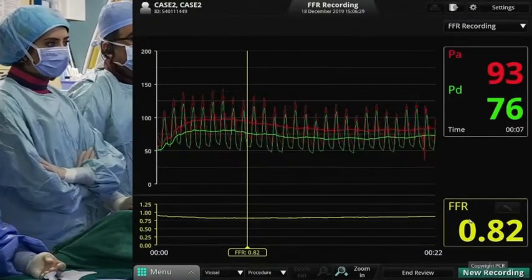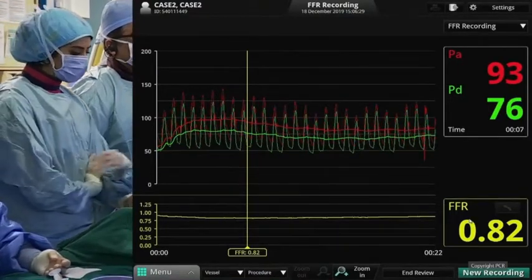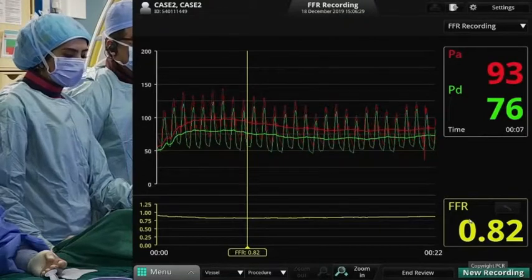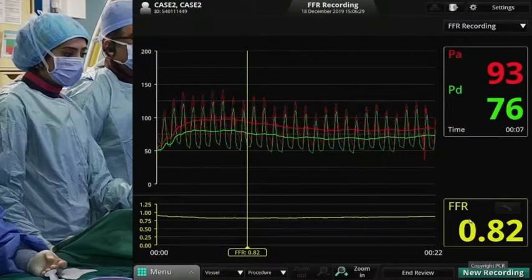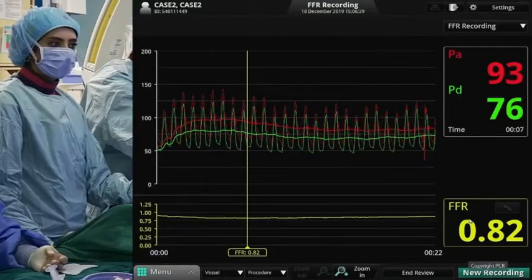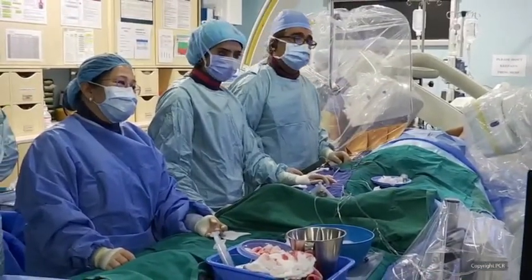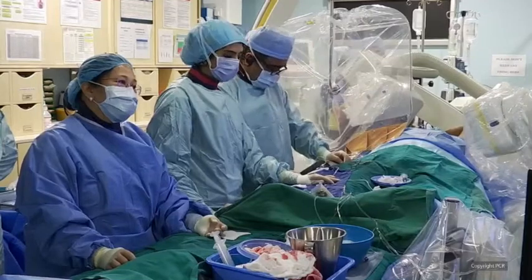And then we moved to do a right heart study and hemodynamic assessment, the baseline. What we got was a mean wedge of 10, RA pressure of mean 5 millimeters of mercury, saturation of the PA pressure was 66.5%, and cardiac index was 2.02. The idea of doing the right heart study in this case was just because he had poor LV function, ejection fraction of 25, and we need to have continuous recording of his hemodynamics during the procedure. I will give it to Hussam. He will tell you exactly what we did so far.